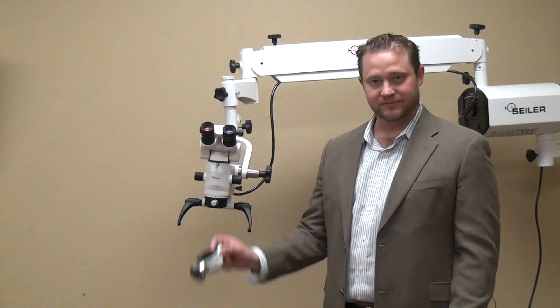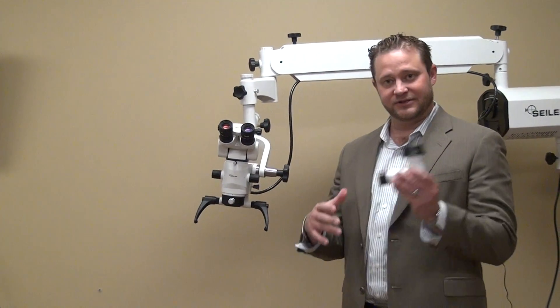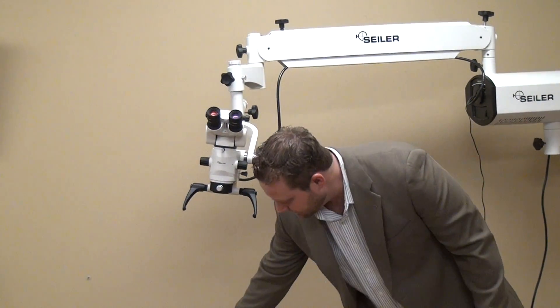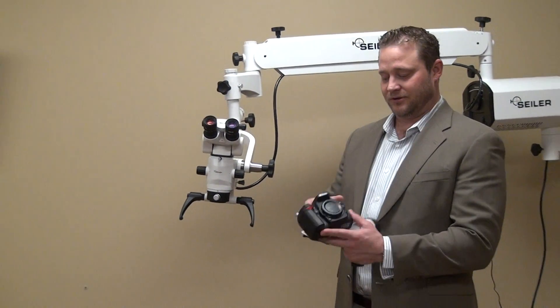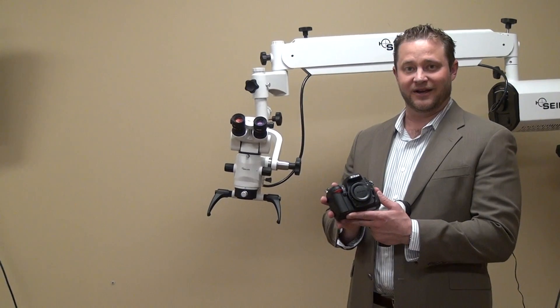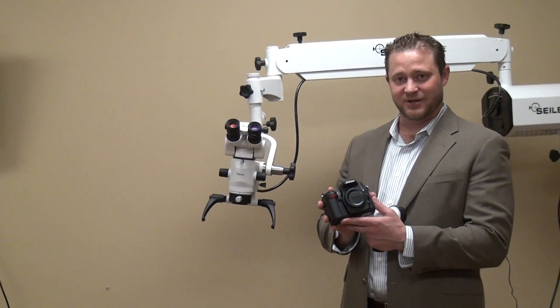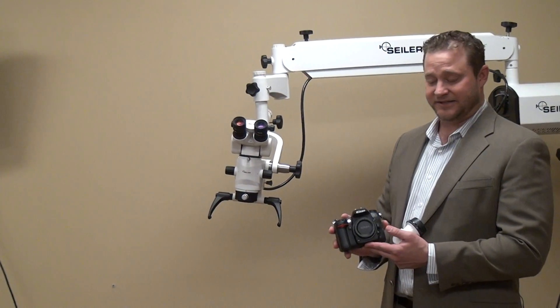The three component parts: beam splitter, digital adapter, and your DSLR camera. Today we chose our Nikon D7000, and we can put on any Canon EOS Rebel, Sony NEXs, or any kind of Nikon D90 and above.